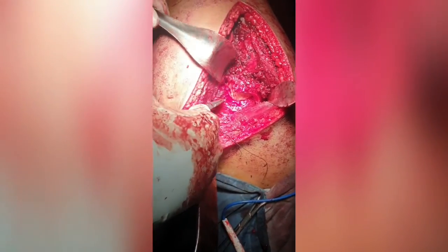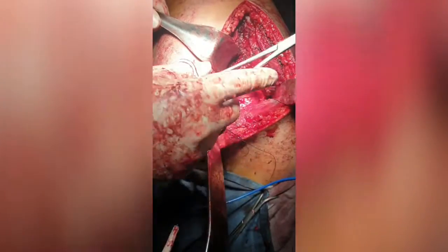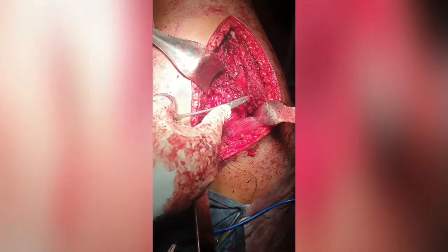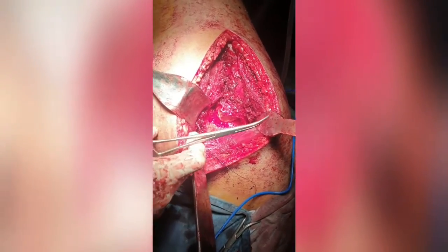So we will fix it in this layer. This retractor is placed on the anterior inferior iliac spine to retract the gluteus medius, and this retractor is placed in the lesser sciatic notch to retract the posterior layer of the gluteus maximus muscle.